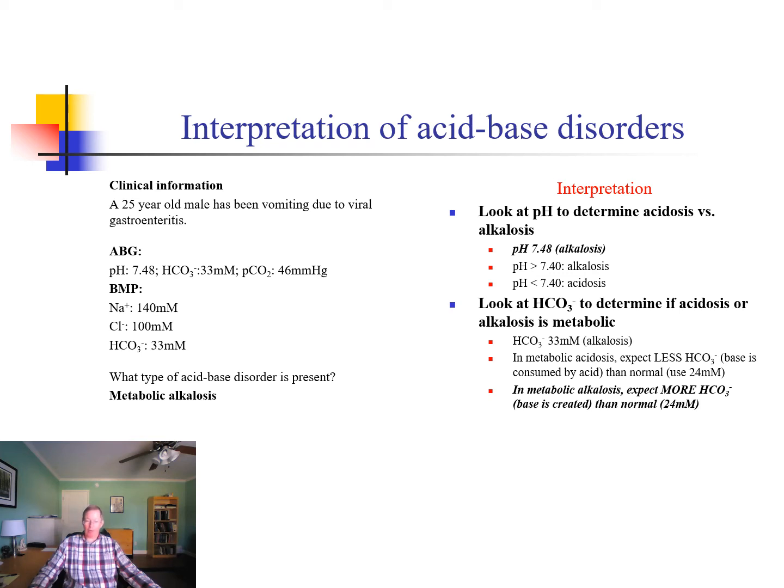Now I want to go over and look at my PCO2. I notice that it's not that 40 millimeters of mercury that it was before. And so why is that? Well, you may remember with the Henderson-Hasselbalch equation that the pH is buffered through this system where I can change the bicarbonate and CO2. And so the CO2, by slight changes in ventilation, will try to buffer that pH so that it doesn't become as alkalotic as what it would normally do. So it moves in the same direction as the bicarbonate. And that's called a compensatory mechanism or compensatory change.